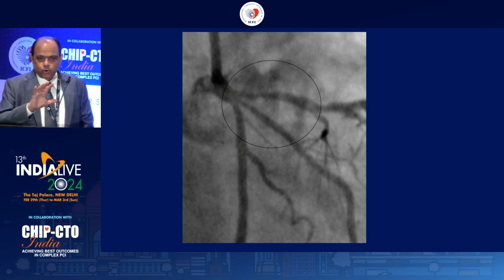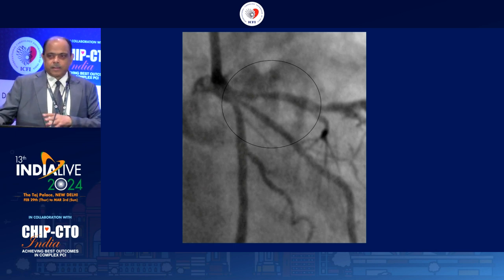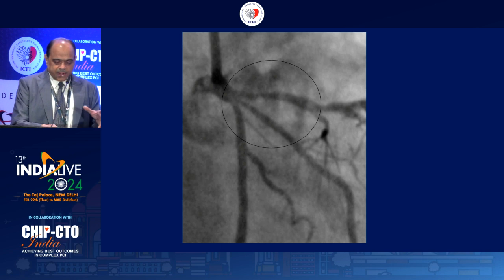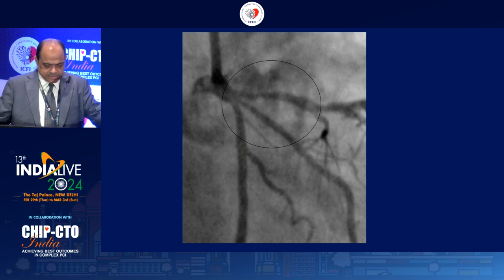There are no guidelines on trifurcation that you should do this procedure. Like bifurcation, you have EBC guidelines that go for so-called layered provisional stenting versus DK. They don't believe in DK crush, so they have their own theory. The Chinese believe that DK crush is best. Scientifically, DK crush is a better technique. But how to apply it to these two branches, which technique is open in trifurcations.